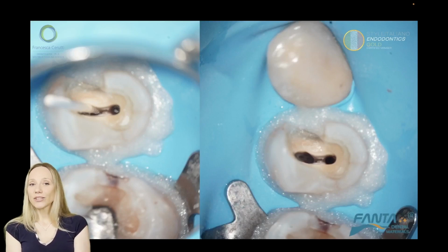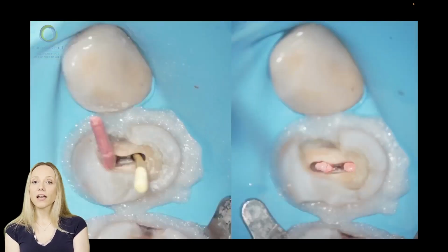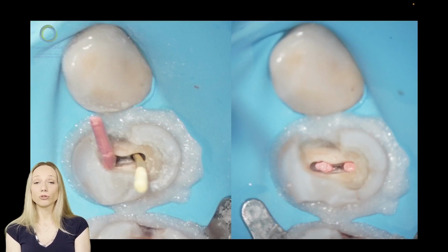So what did I do? I shaped only the main canal to the working length and then I cleaned, I did everything, I shaped the other root canal up to the confluence, and the same will be done during my root canal obturation.